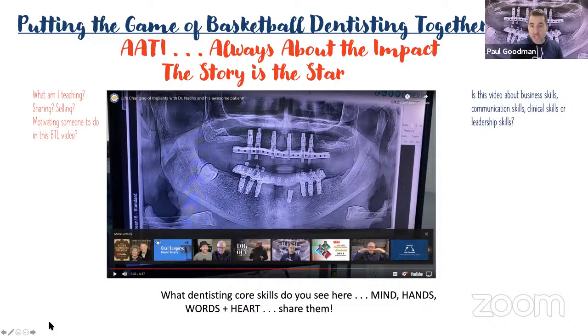So this is traditional. This was done in 2008, still working 13 years later at the time of this recording. 2008, stay-in-all-the-time teeth. This is a titanium bar, acrylic teeth. 7 implants on the lower, 6 implants on the top. We bring the patient in for maintenance. How often do we remove it? In general, we remove it when there's a problem.